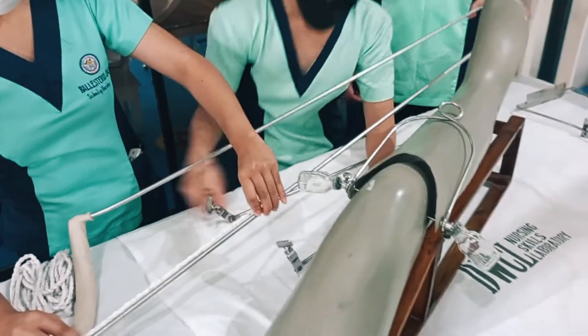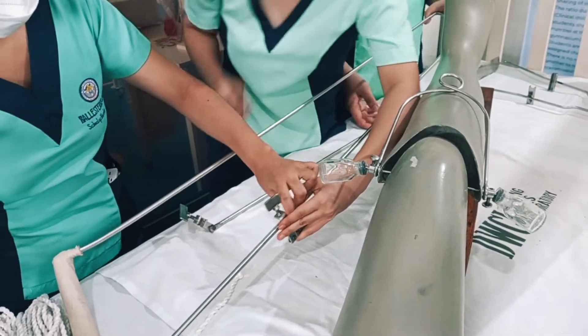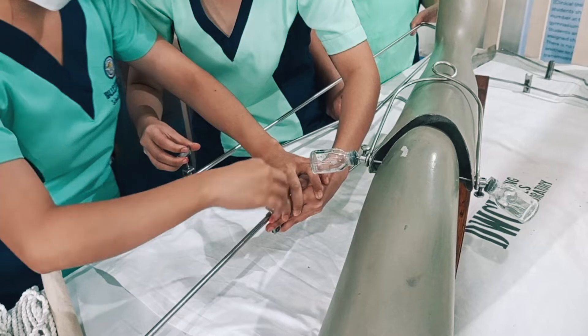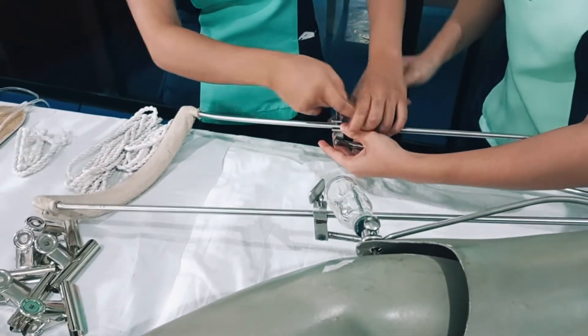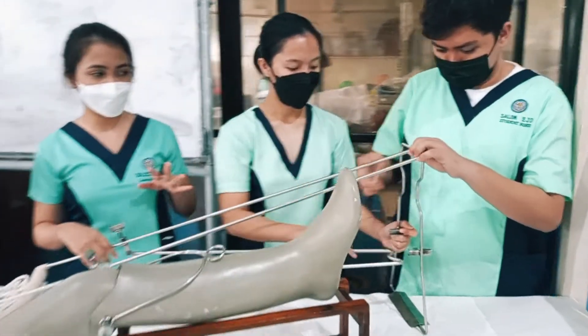You can now attach the Pearson attachment to the Thomas splint based on the measurement you have obtained. Then place the rest splint. The Thomas splint with Pearson attachment is now prepared.